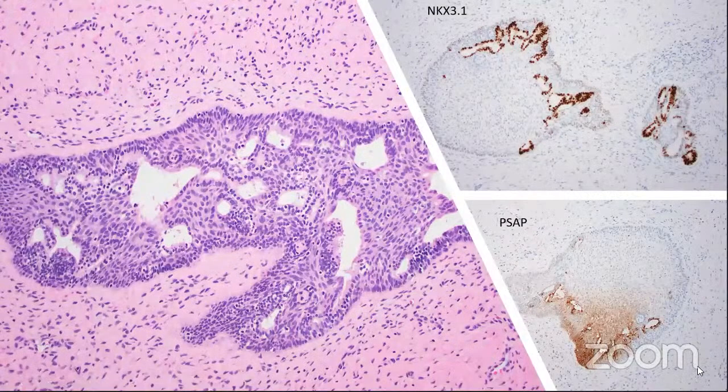So I just want to take a few moments to talk about ectopic prostate. This is usually an incidental finding in the wall of the cervix. It looks kind of funny, and typically what you see is a mixture of glandular and squamotransitional epithelium intimately admixed.